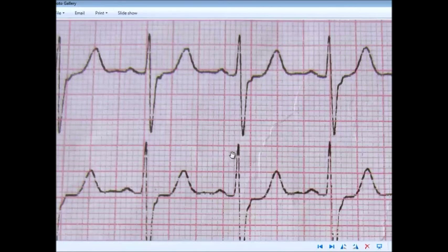So we are kind of in the middle of 75 to 100. Let's say it would be between 85 to 87. So by this we can calculate the heart rate is 87. And if we calculate it by 300 divided by 3.5, we again get the heart rate of around 85.